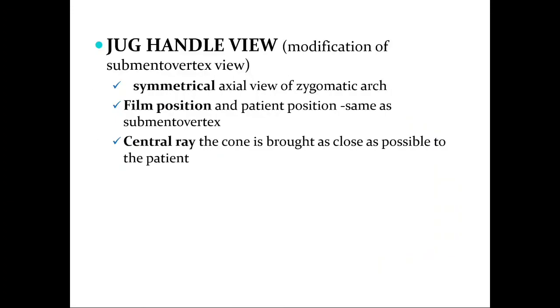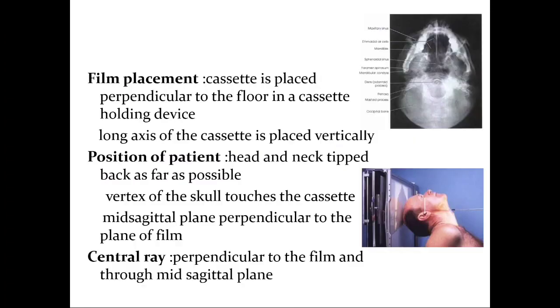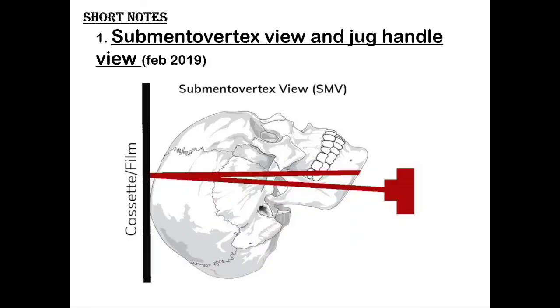And next is the modification of the submentovertex view. There is a jug handle view. And sorry, I have not mentioned over here the indications of the submentovertex view, which helps to check for fractures or any tumors of the zygomatic arches. Also, to check for any skull base tumors, you can use the submentovertex view.